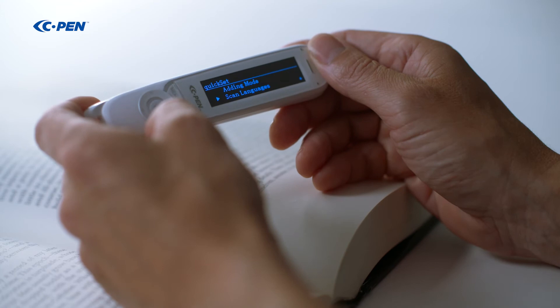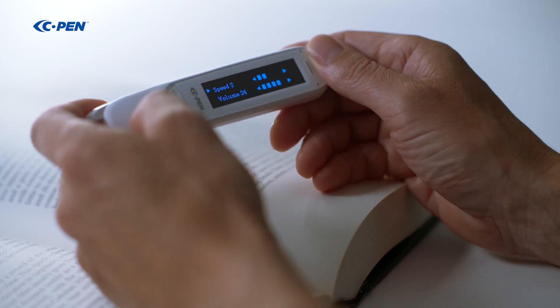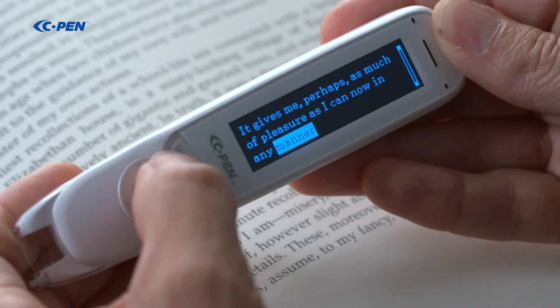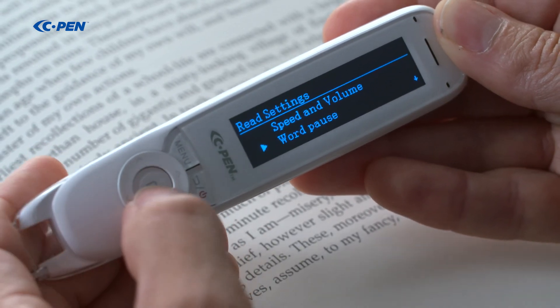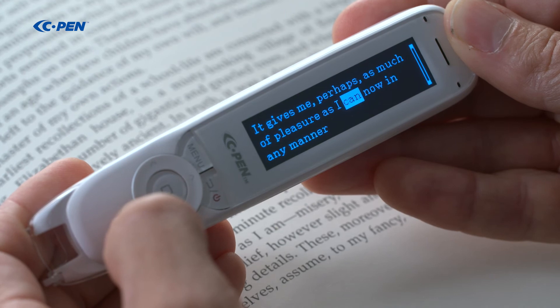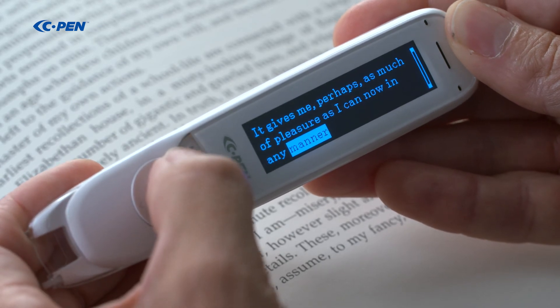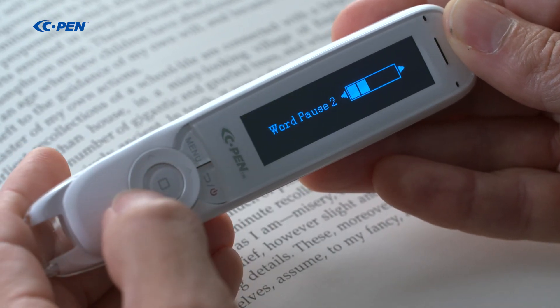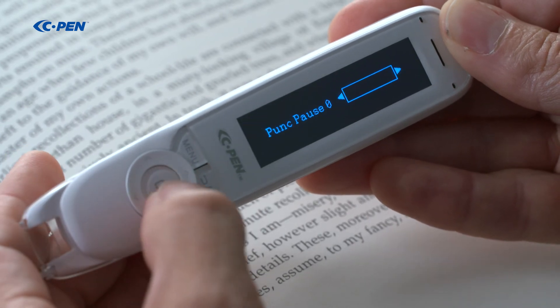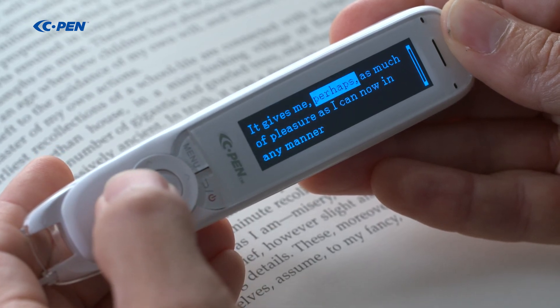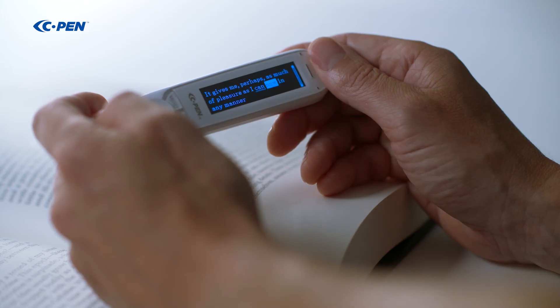Now let's see what we can do with the reading settings. First, let's reduce the reading speed — demonstrating with "can now in any manner." Then, adding a pause in between the words produces clearly separated output for each word. Let's reset the speed and remove the word pause, but add a punctuation pause. Pay attention to the extra pause around the word "perhaps" when re-listening: "It gives me, perhaps, as much of pleasure as I can now in any manner."